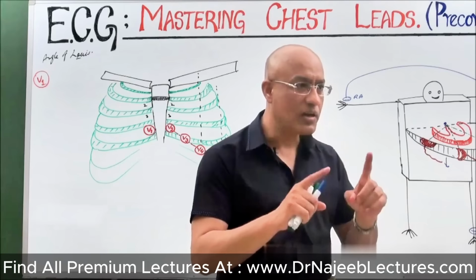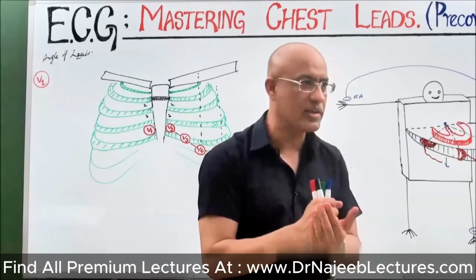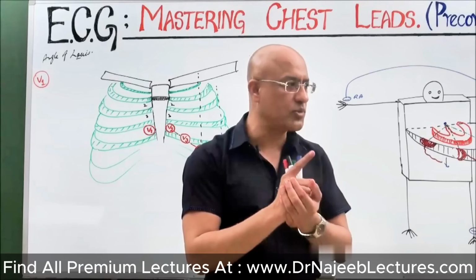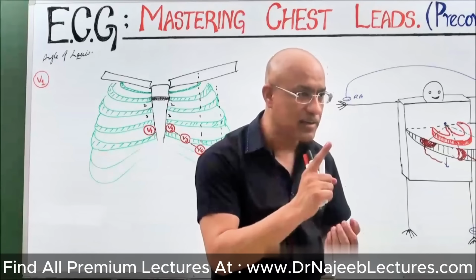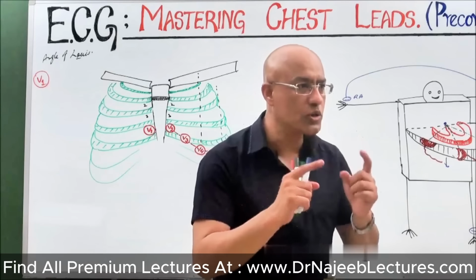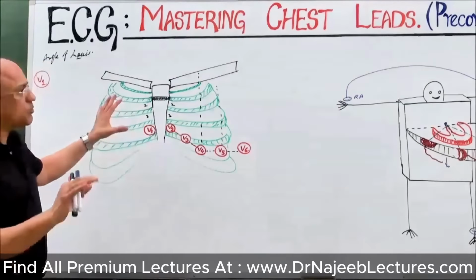You know that. Good. So the point which I want to stamp on your brain is that these are chest leads, not breast leads. So don't get confused when a lady with a large breast comes for ECG. You are supposed to put chest electrodes V3, 4, 5, 6 underneath the breast, not onto the breast. Second point, which I will also repeat: please use the bony landmark to determine the intercostal spaces. Don't use the nipple position, which is very deceptive. Clear? Okay.